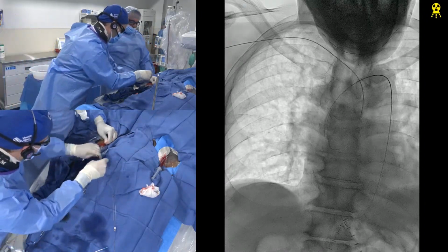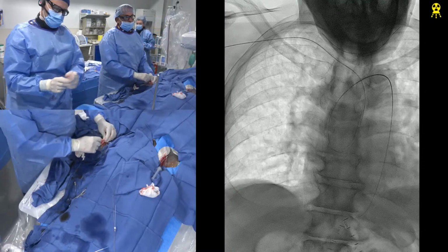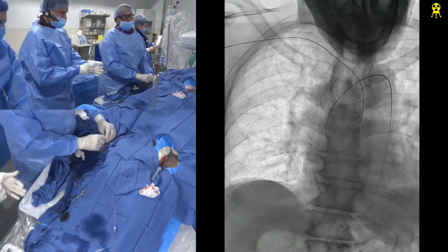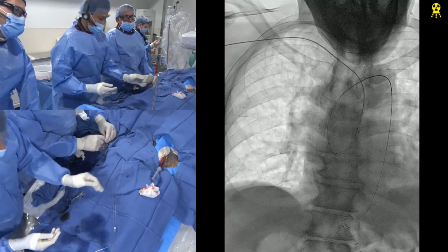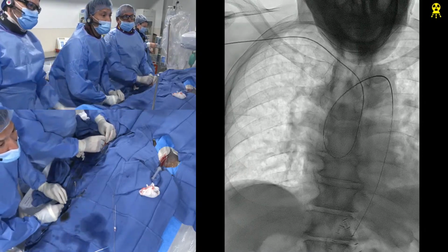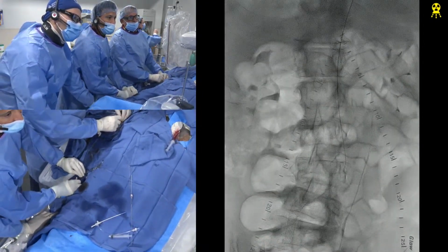So now we're just going to advance this catheter in very slowly. Hopefully it doesn't prolapse out, which it may, and if it does, we have to deal with it. You put a glide cath probably. Well, this is a glide pig, it's the same thing. It's not stiff. Push the wire down and see. When I get over the arch, you have to push the wire down a little bit. Now just put in the wire. Show me the wire distal. Got to watch the wire in the renals. Beautiful.